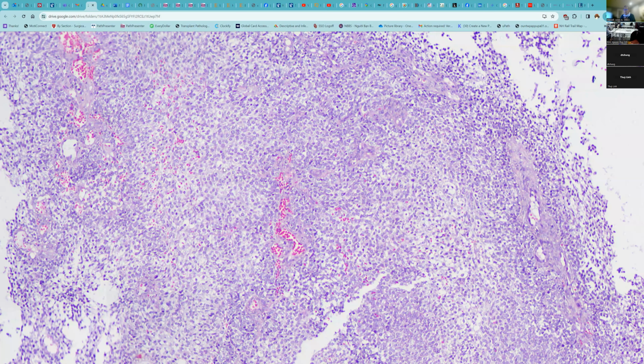So that's my impression, that this is a high-grade, probably carcinoma, and I would imagine that it's either going to be in the INI1-deficient or BRG1-deficient category, or potentially in the Epstein-Barr category. But I can't rule out some of those other lesions as well.